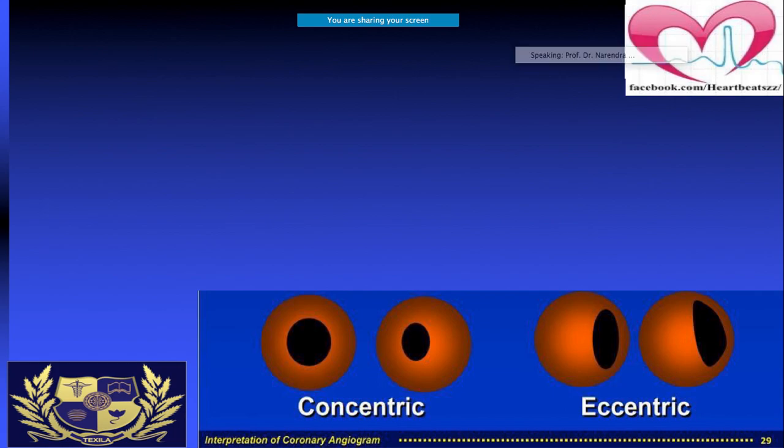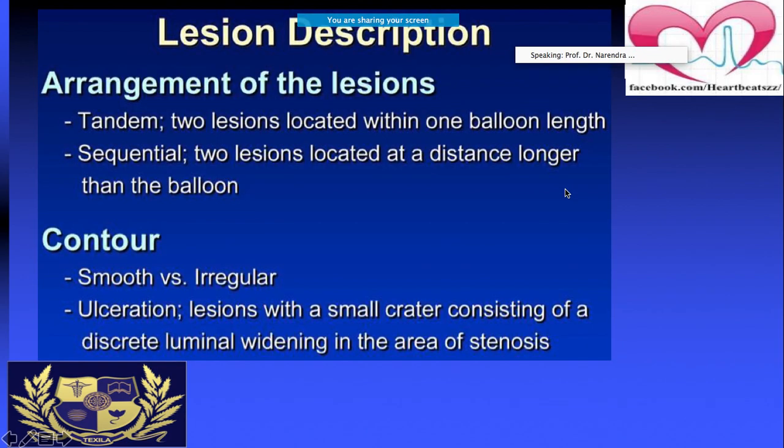So now I think you all should have a bit of an idea what is done during the coronary angiography, what are the things which we do, what happens in the cath lab, isn't it? So we had already described what are the different views which are being used, what are the different types of ways to describe a lesion as well, what is being used for doing the coronary angiography, how do we start describing as well.